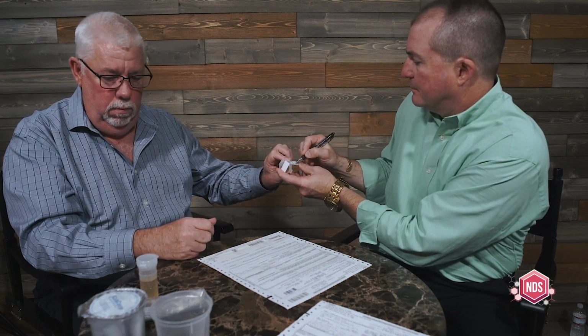And we're going to pull off our seals carefully so that they don't rip or anything. And we're going to go to the A bottle first, the one with the most specimen. And we're going to put that right over there. I am going to date that. And I'm going to ask you to initial it, Tom. And we're going to do the second specimen. You might as well hold that pen for a second, as you're going to initial the second one also. Go ahead and initial that, and then I'll date it. All righty.